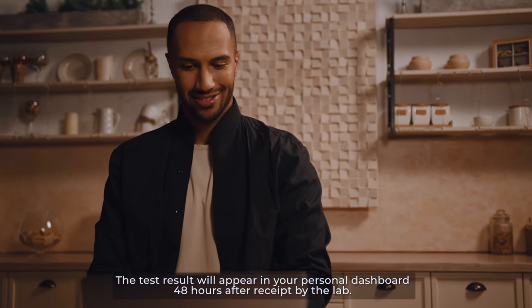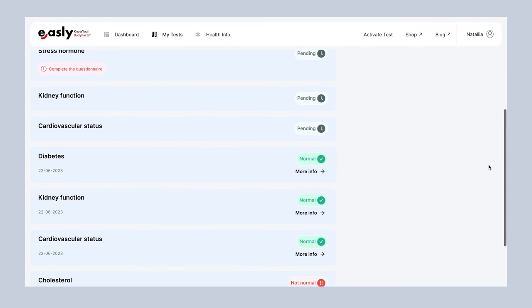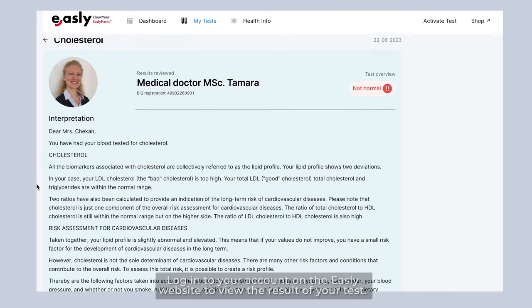The test result will appear in your personal dashboard 48 hours after receipt by the lab. Log in to your account on the Easley website to view the result of your test.